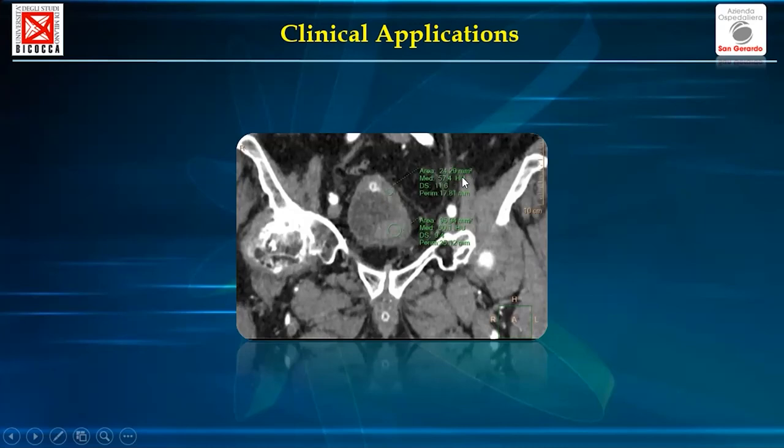We can recognize that the absolute value is almost the same, almost 60 Hounsfield units. And now I may ask you, which could be the tumor, the upper one or the lower one? Lower. Okay, all of my colleagues said the lower, so I agree with the others.